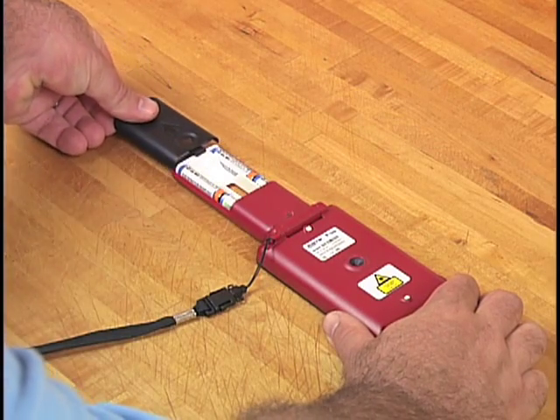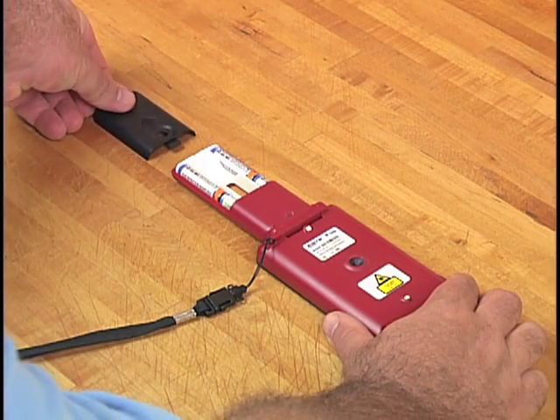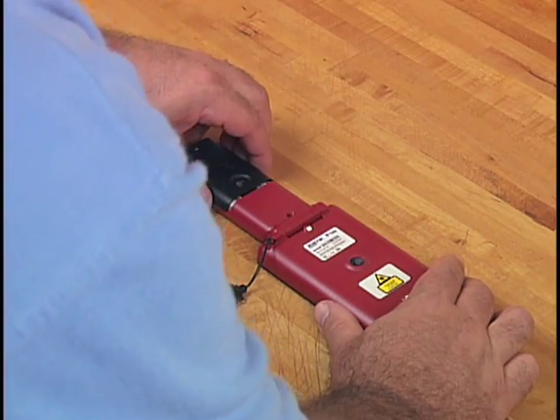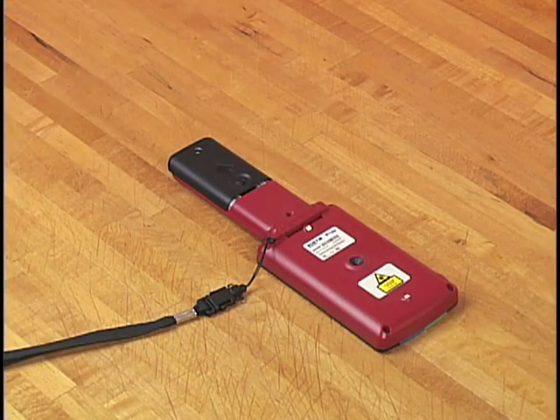The rechargeable batteries are in the handle for comfortable balance, and I get over two hours of continuous use. The Ruby will also run on disposable alkaline batteries.